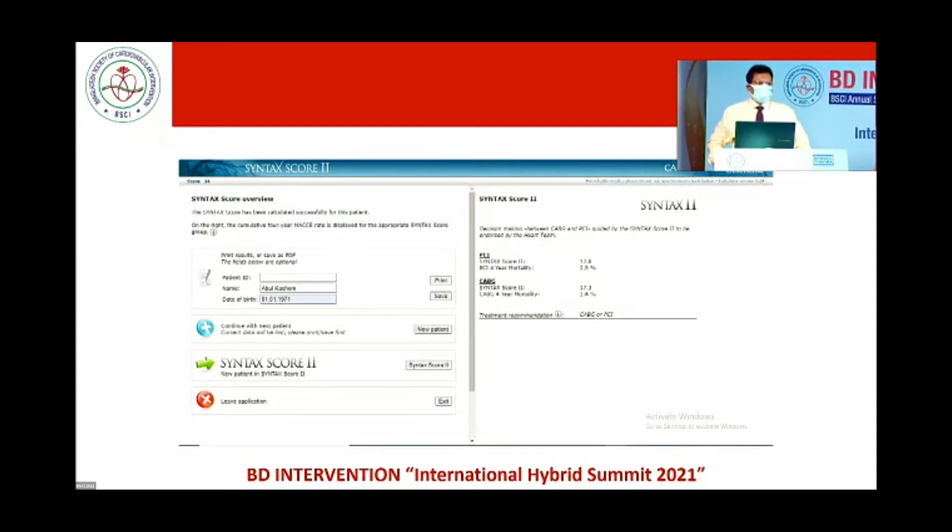If the patient is on maximal medication, I think you can take the help of the distal left main. It looks like 30-40%, but if we assess it by IVUS or by OCT or even by FFR, that can give you the clue whether it is critical or not. Sometimes angiographically left main may look 30-40% in one angle. In a different angle, it may be 50-60%.